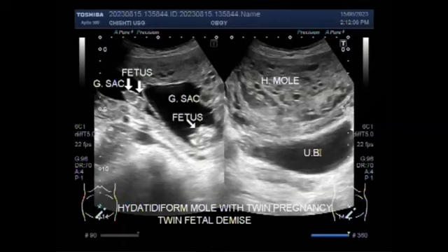On ultrasound, the hydatidiform mole looks like a bunch of vesicles with interspersed fluid seen in the whole of the uterine cavity. Mostly painless vaginal bleeding during the second trimester of pregnancy is seen. They are diagnosed by ultrasound imaging. Extremely high levels of human chorionic gonadotropin (HCG) are suggestive, but not diagnostic, of molar pregnancy.